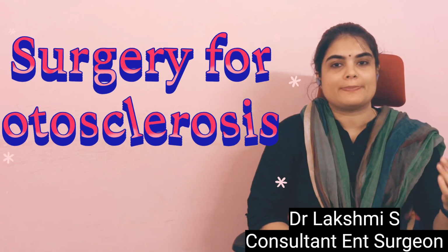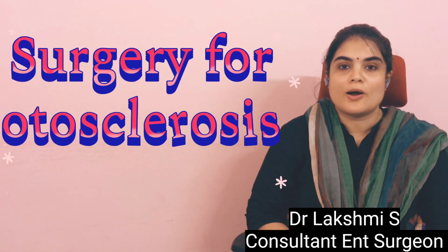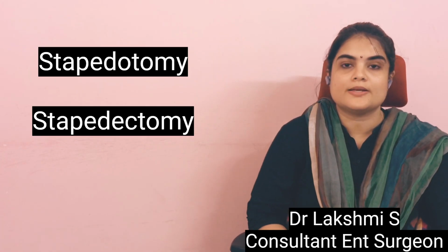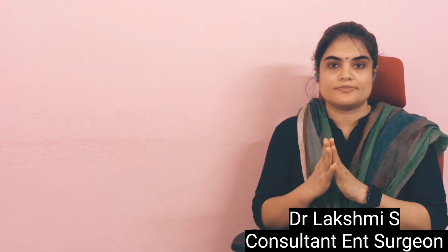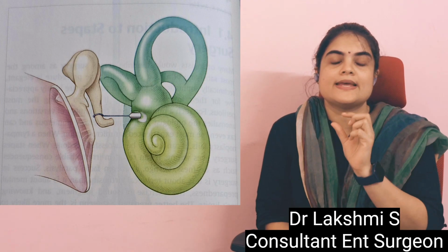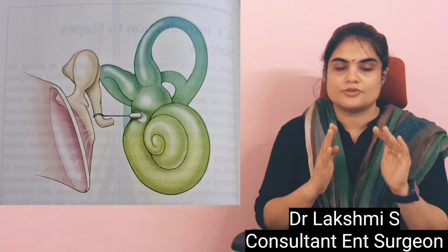As a continuation of the previous video, today we'll be discussing the indications, surgical steps, complications and contraindications of stapes surgery. The main surgeries performed are stapedotomy and stapedectomy. The problem is the stapes footplate is fixed and immobile. So we create a small hole in the stapes footplate and then attach a piston to the incus so that the piston performs the function of the stapes and the mobility of the ossicular chain is restored. That is the main aim of the surgery.